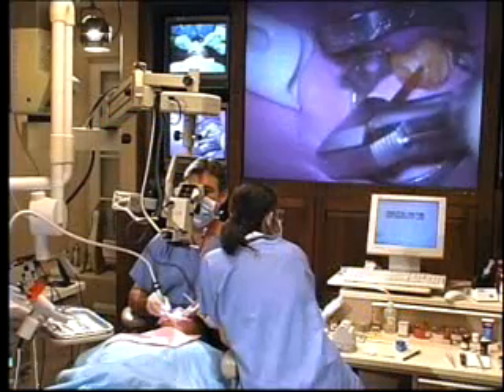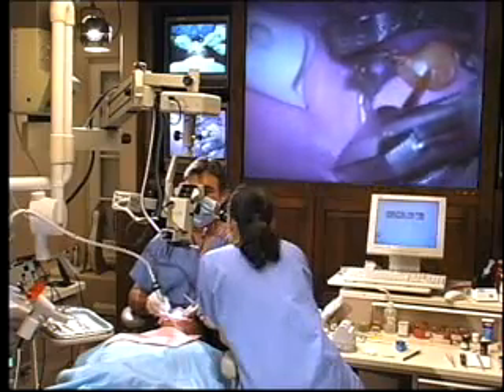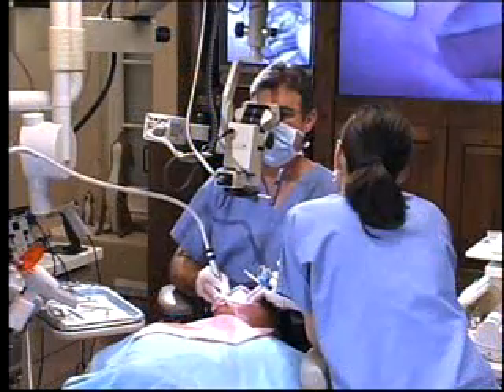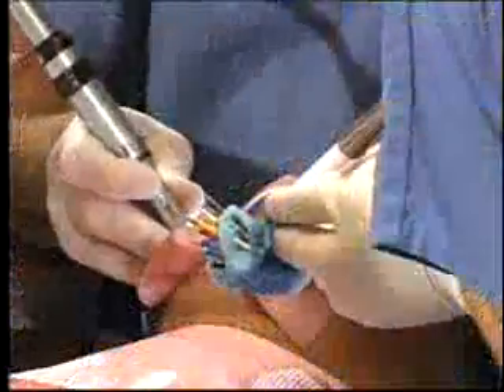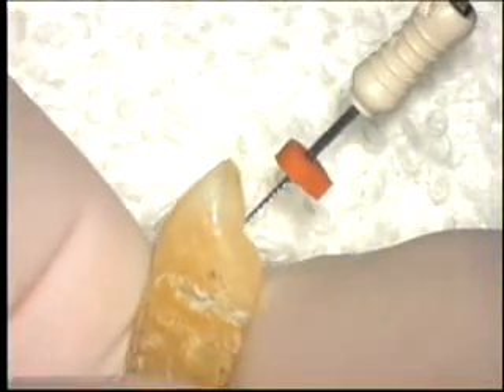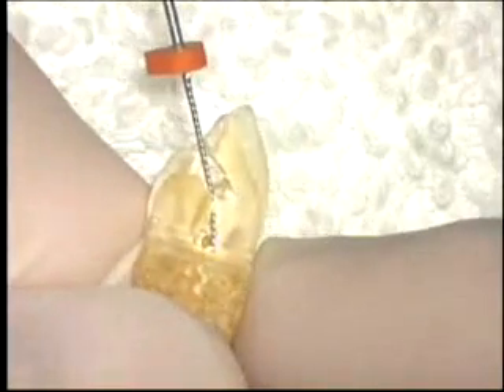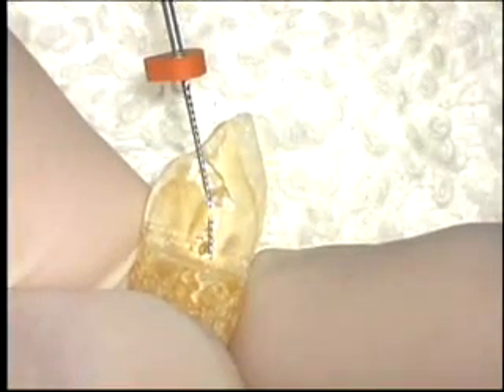The rapid adoption of rotary files by specialists and generalists alike has created an even greater imperative for creating ideal convenience form and access preparations. While clinicians can get away with mediocre access preps when using hand files, they will be quickly and severely punished for the same shortcomings when using handpiece driven instruments.